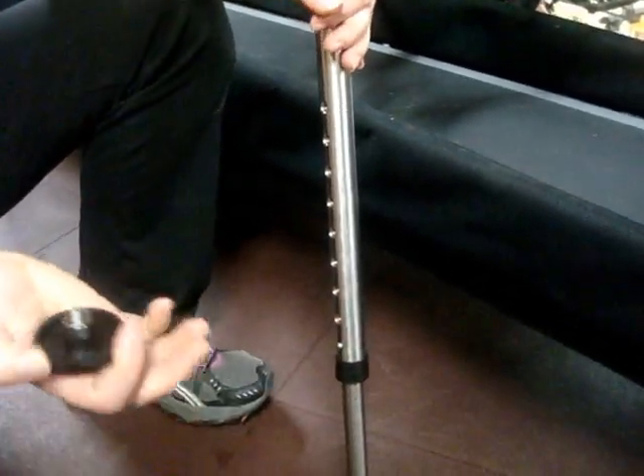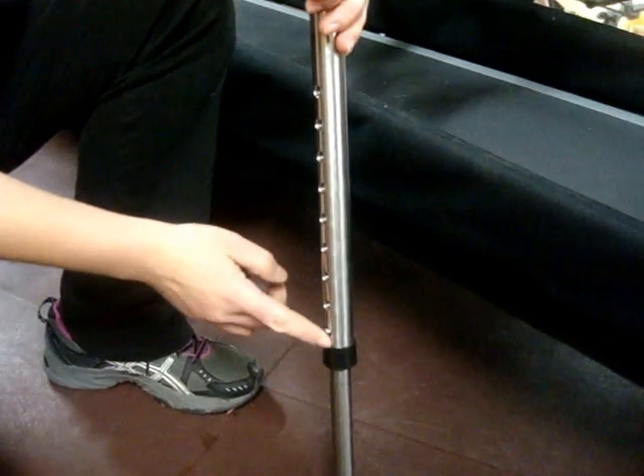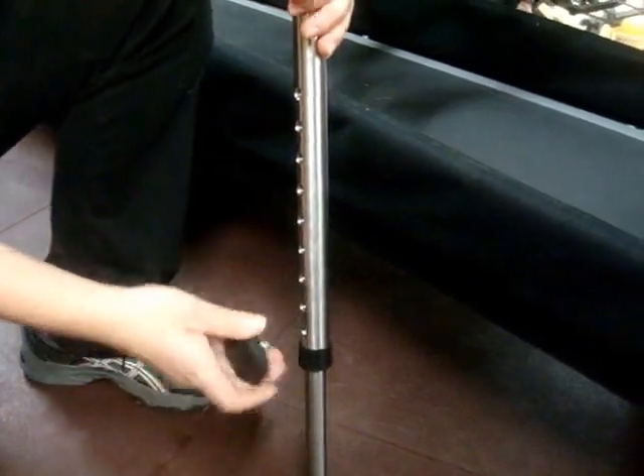So we have our height adjusted and we want to take this and move it down two inches. So we're going to lower it by two inches.